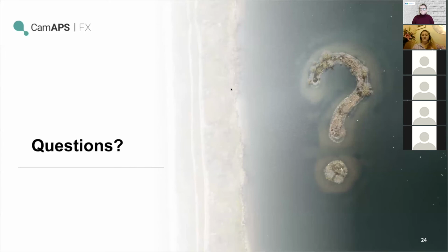So you can view the data, as you saw when the phone is turned landscape, and you can scroll back quite a long way, months actually. But it's usually more helpful to log onto your actual DiaSend account and look at the data displayed in that format. People who want to keep an eye on maybe younger children can download the DiaSend app to their phones and link it to the same DiaSend account. It's not real time, but it's usually 1 or 2 minutes behind, as long as the person who has the phone has Wi-Fi or a SIM card in there.